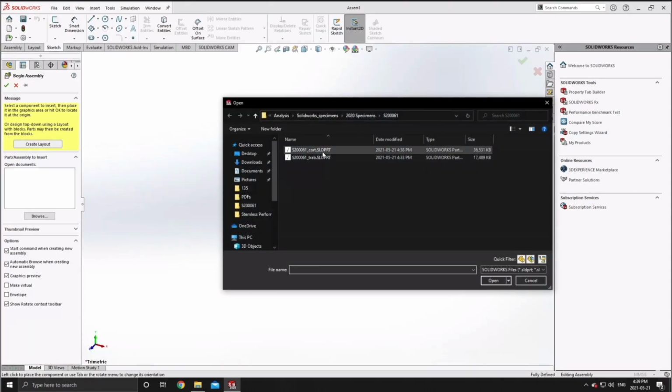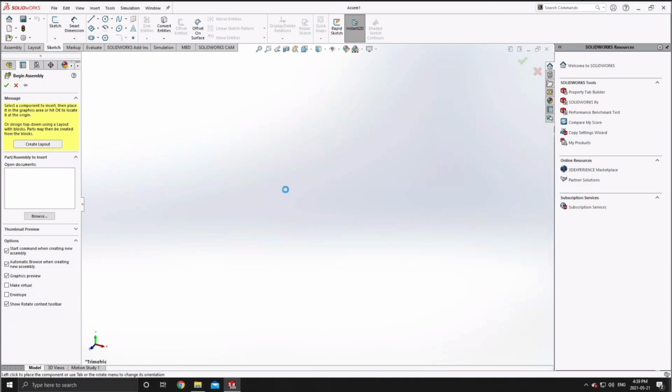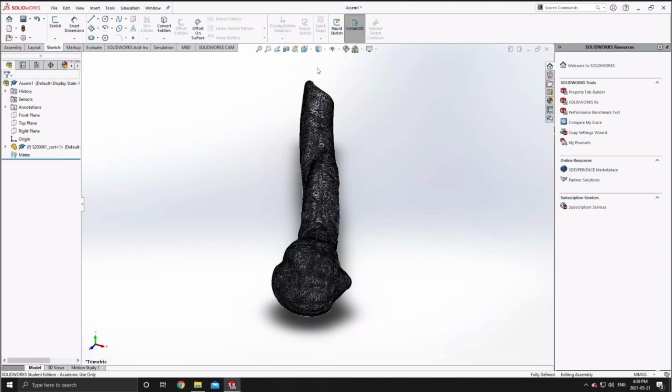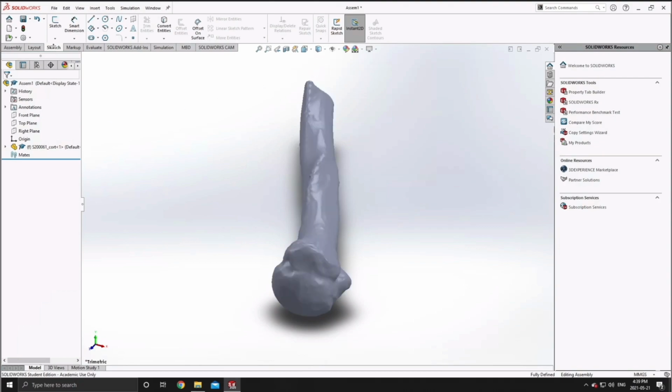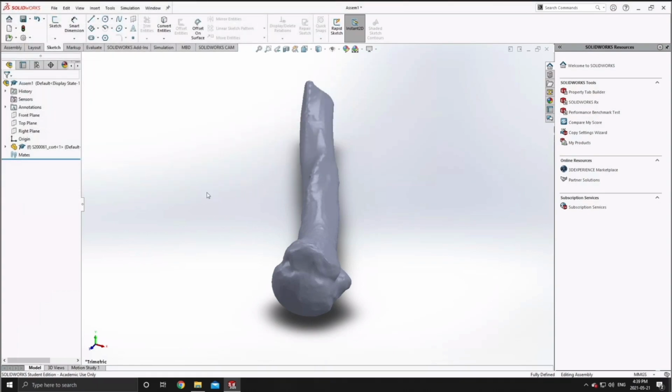So one key thing to keep in mind when you're creating these assemblies comprised of your exported Mimics parts is you're going to have to make sure your coordinate axes align correctly, as when we bring this file into Abaqus, it's going to retain the same origin and coordinate system as it was initially assigned in Mimics. And for material assignment purposes, it's absolutely essential that we align those axes correctly.